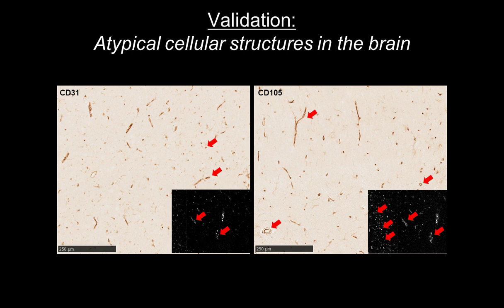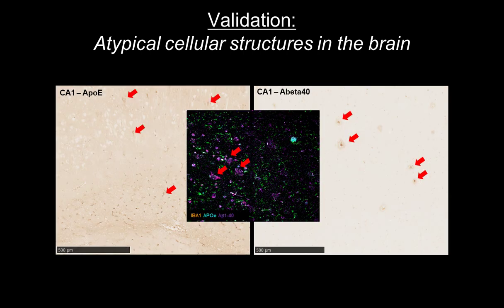So the strategy that we took, for better or for worse, is again, trying to leverage pre-qualified antibodies that people have already established and used widely, get the metal conjugation on them, and then we would do serial analysis of serial sections of the same control blocks, where we would take one section and do regular single color DAB staining that you can see here in brown. And then on the serial section, we would stain with the metal conjugated antibody alone and run that by multiplex ion beam imaging to see if we got the same map, the relatively same distribution of the marker in the same shapes with the same signal noise, and we'd titrate things accordingly.